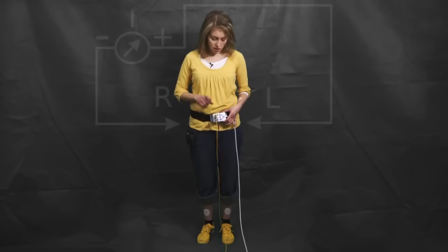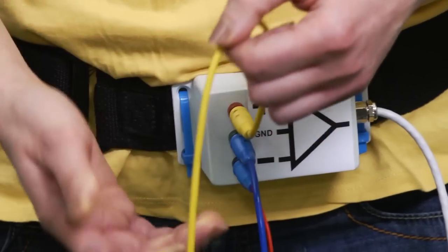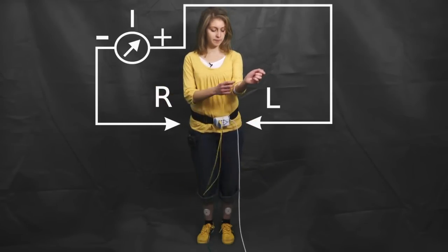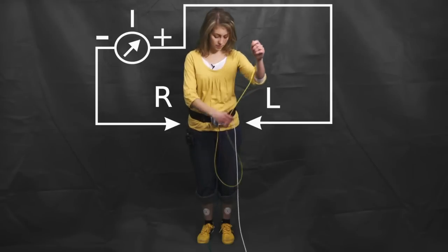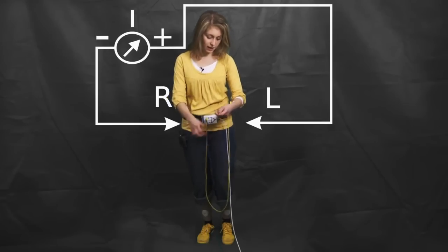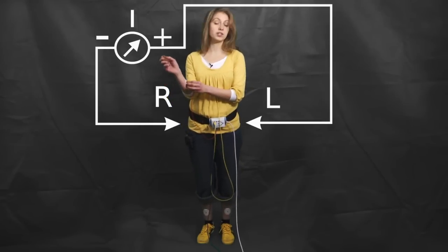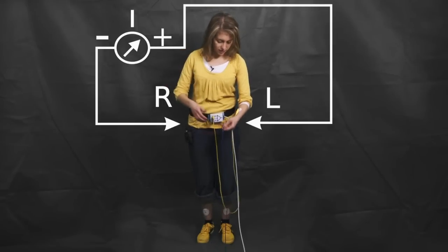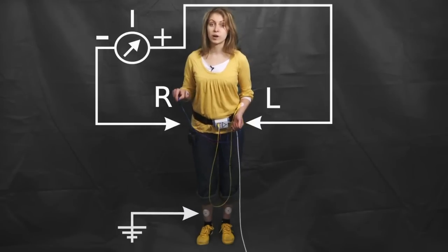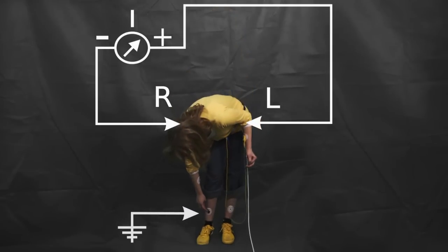Now let us measure the Eindhoven 1, 2, and 3 leads one by one. For Eindhoven 1, we take the positive input — the yellow cable — and connect it to the left arm. Then we take the negative input and connect it to the right arm. And we take ground, the blue cable, and connect it to the right foot.